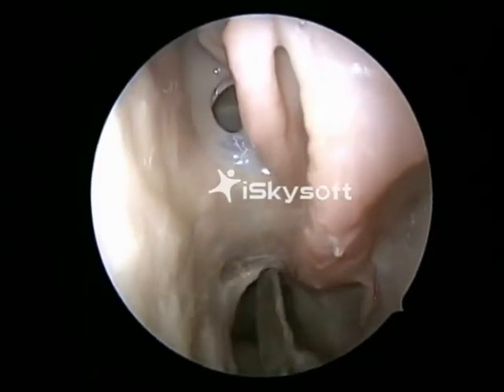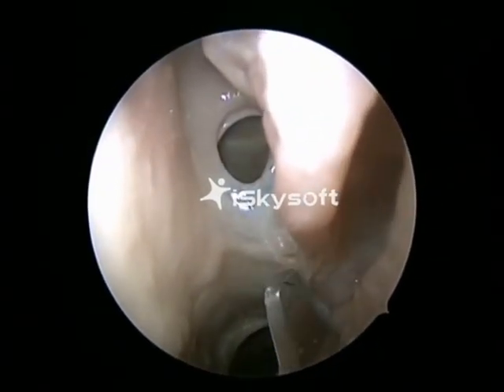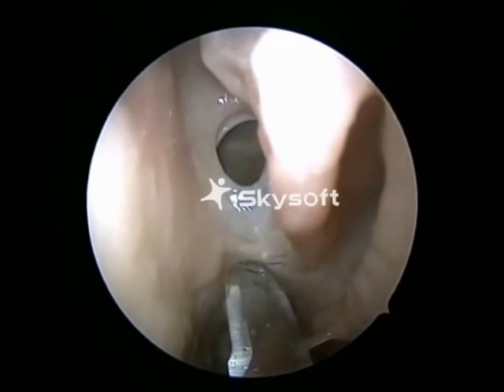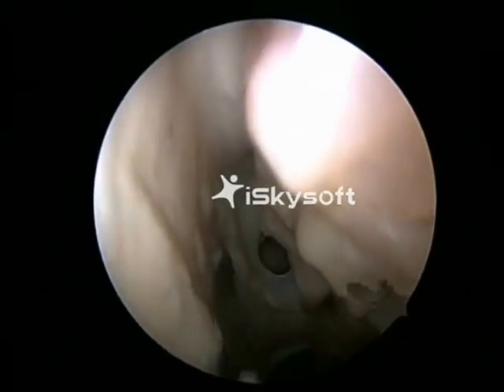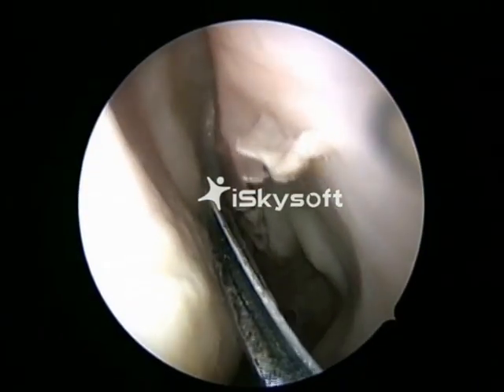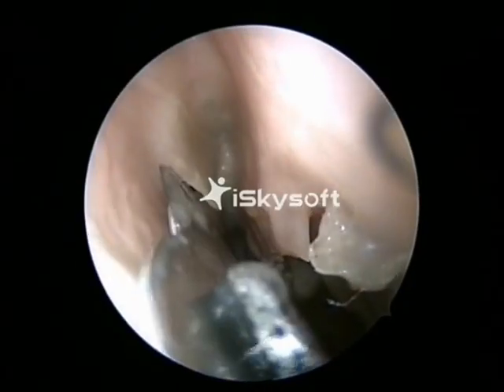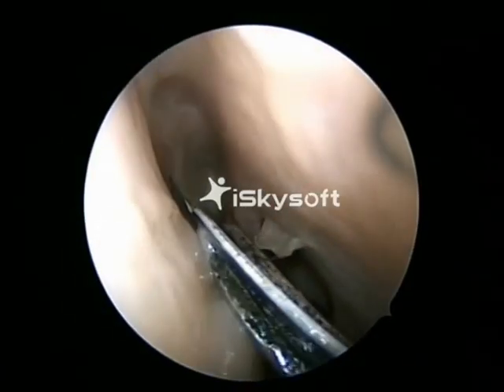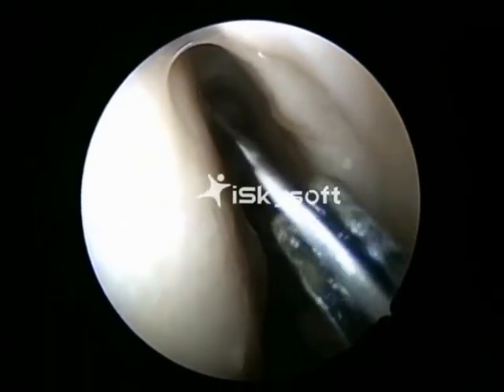The next incision is made along the floor of the sphenoid sinus, and it is carried along the roof of the septum, and then a Freer's hemitransfixation incision is used to connect both these incisions.